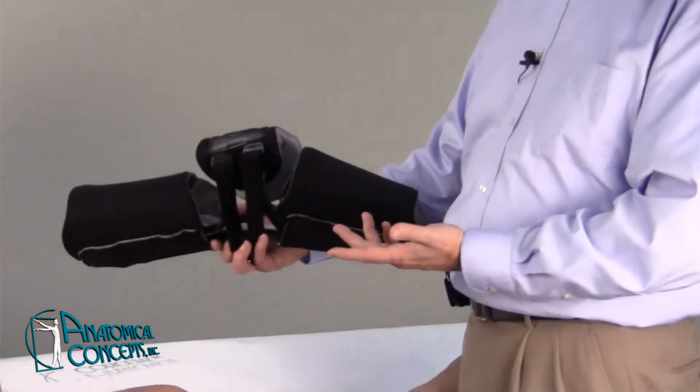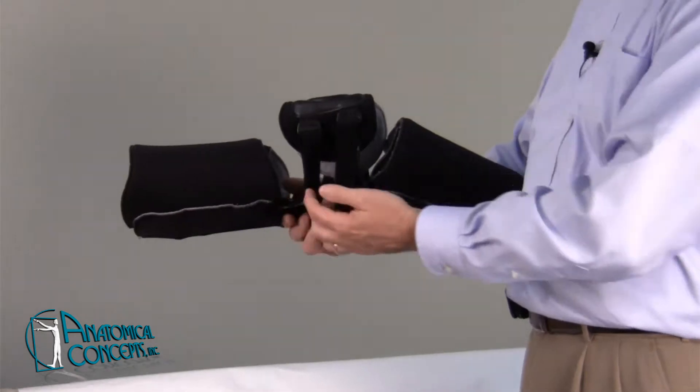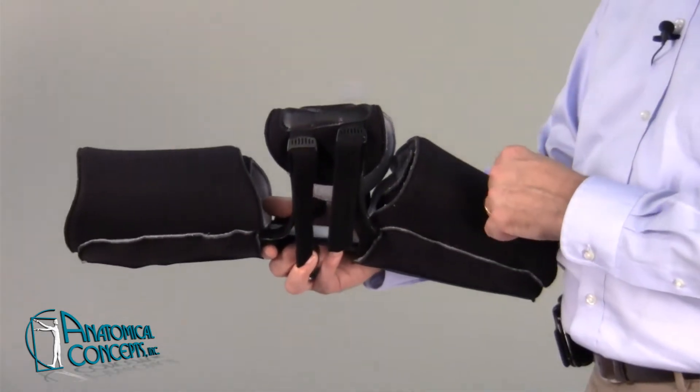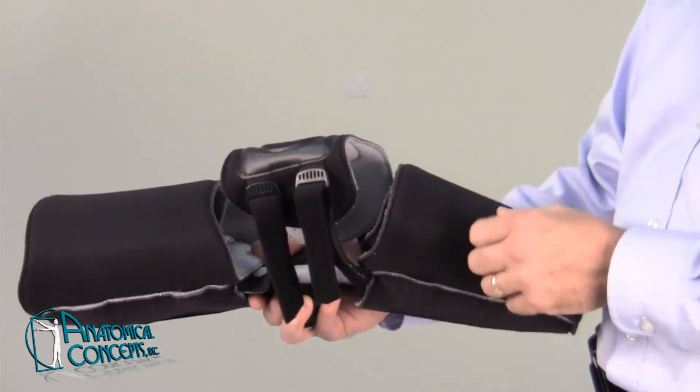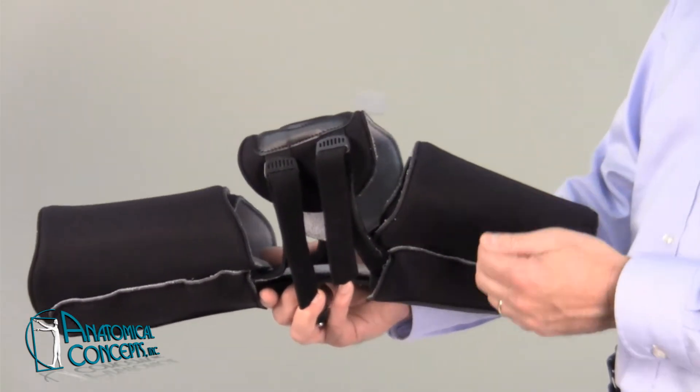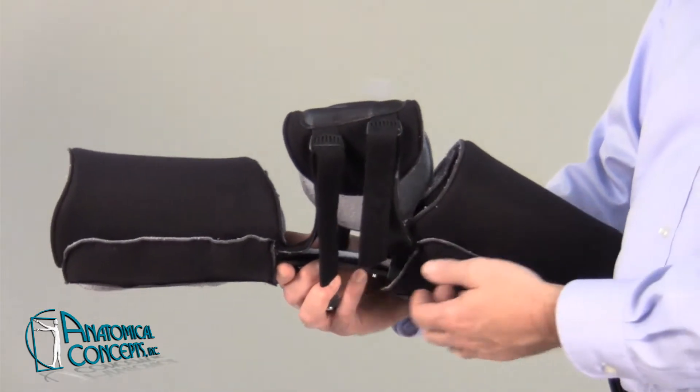What it consists of — this is the actual KMO itself, and many of you may be familiar with it. We used to have two Velcro straps on the calf and two Velcro straps on the thigh. We've eliminated those and added a piece of Velcro on the closure of the calf and the thigh. We do have a separate strap that can be added if you so choose, and I'll go over that later in today's video.